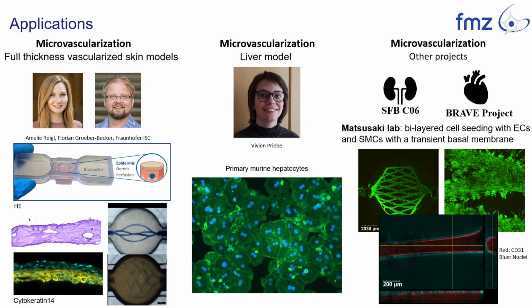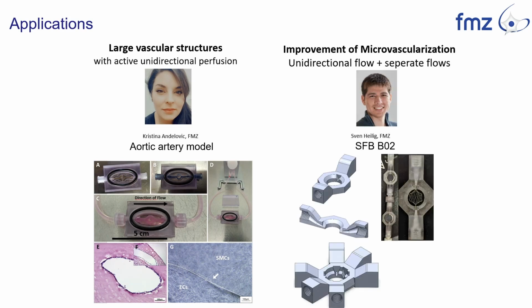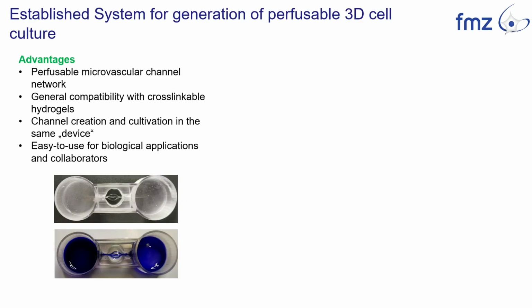We are working on seeding SMCs and ECs together, which are first divided by a transient basal membrane, which prevents the overgrowth of the different cell types above each other. We are also using larger structures for unidirectional perfusion to create aortic artery models. And we are also developing these perfusion chambers in the direction of our unidirectional flow to combine them with conventional pumping systems. So the advantage of this method is that we have a perfusable microvascular channel network in hydrogels without any remnants.